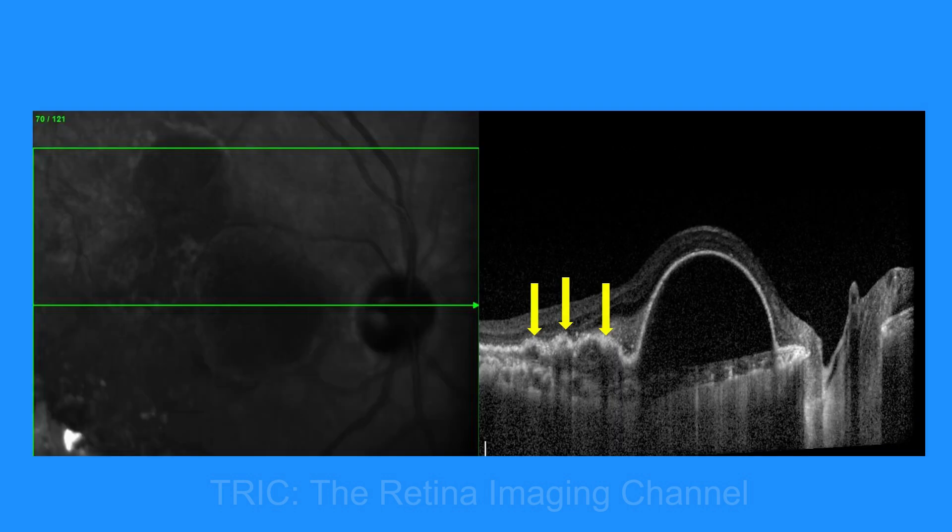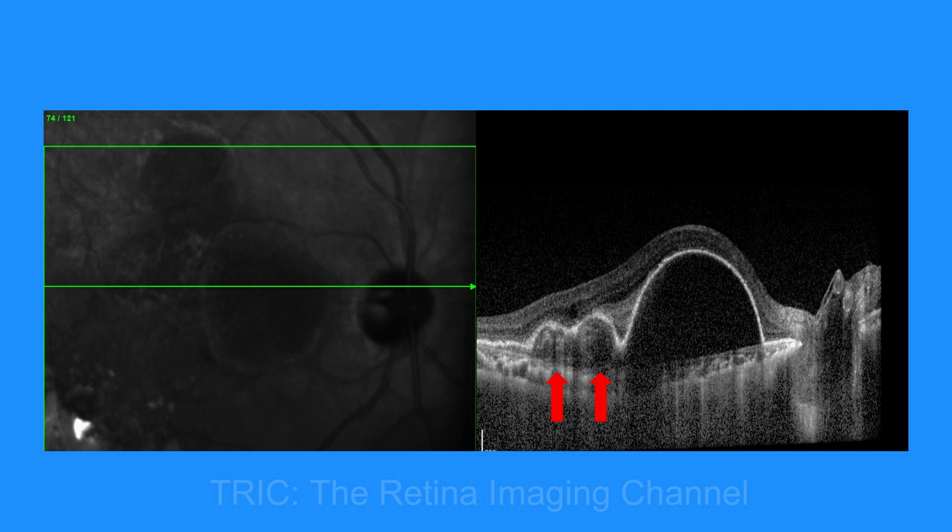Another line scan a little further up shows that the undulations have increased — the undulations turn into two thumb-like PEDs adjacent to the large serous PED. This thumb-like PED is a typical feature of IPCV.